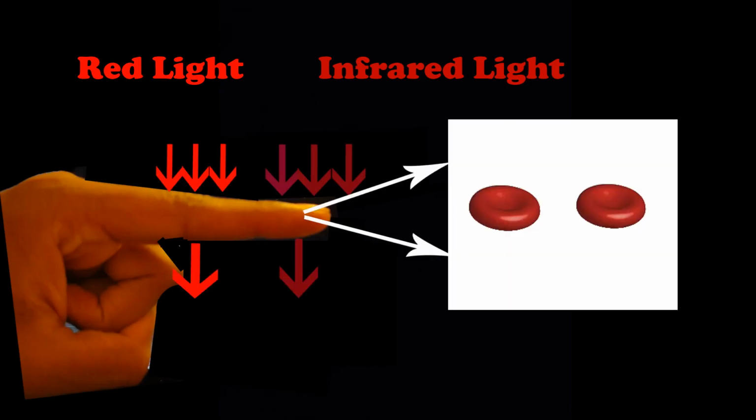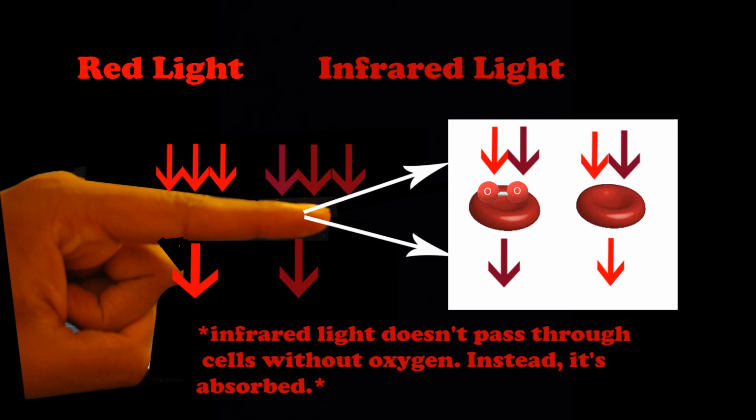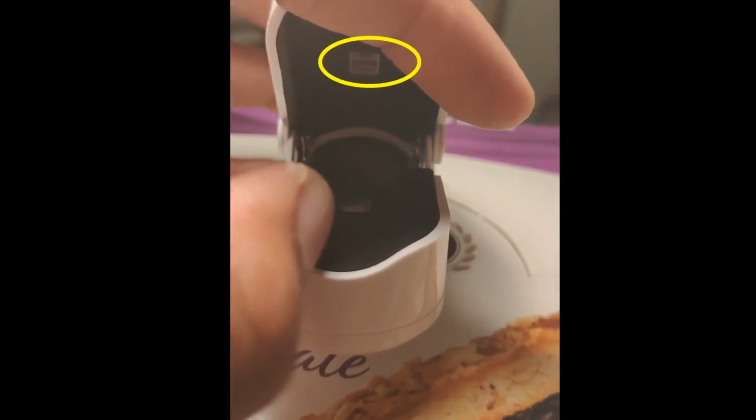If there are any blood cells in the way of the light, these cells are going to absorb that light. The red blood cells carrying the oxygen are going to absorb the red light, and the red blood cells not carrying any oxygen are going to absorb the scary, invisible infrared light. Second order of business, look up. See that window right there? Yep, that one right there.